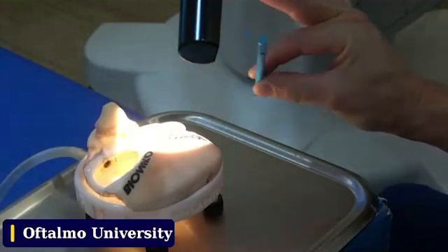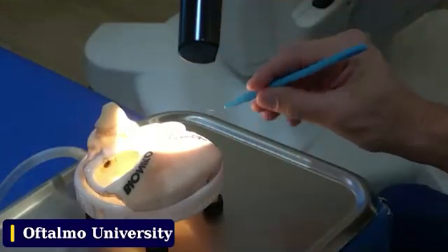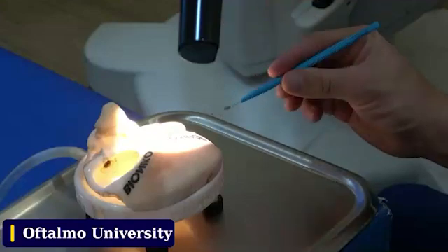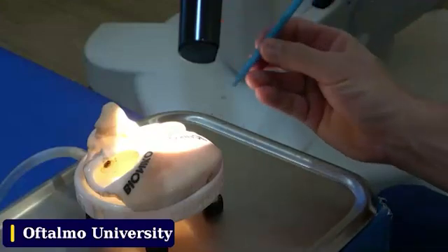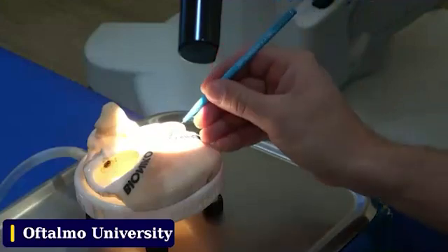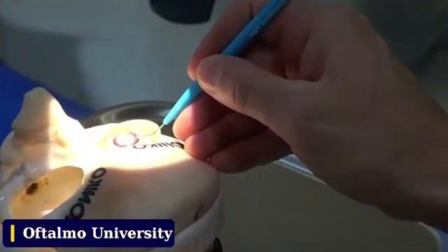This is incorrect, this is incorrect — you lose the movement. And this is incorrect too, you lose the movement, meaning that everything is touching incorrectly. So: fixation point, where to grab it — and there you go.